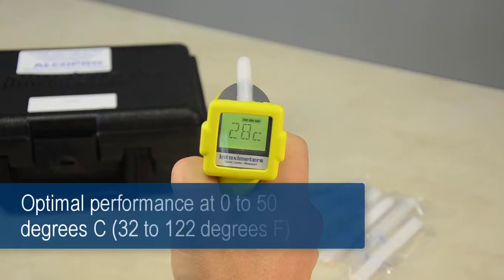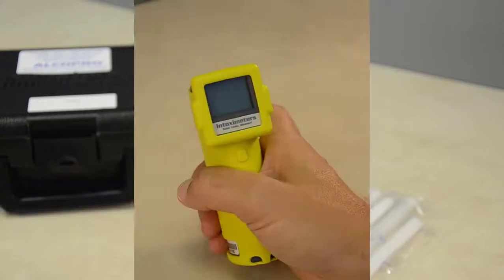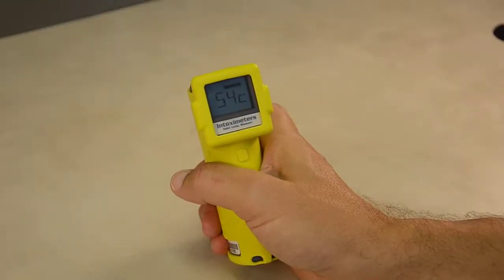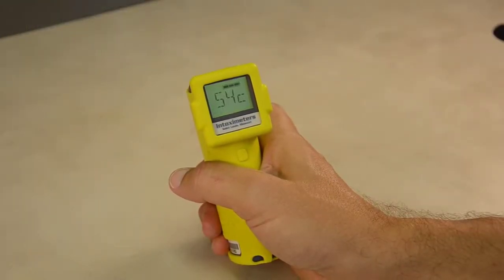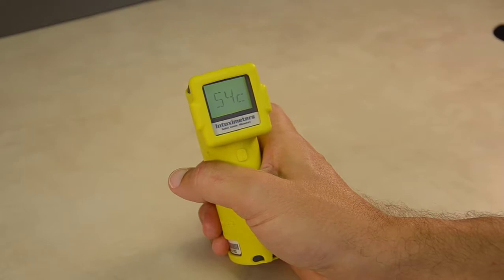The AlkaSensor FST is designed for optimal performance at instrument temperatures of 0 degrees Celsius to 50 degrees Celsius, which is equivalent to 32 to 122 degrees Fahrenheit. If the temperature is outside of the proper operating range, the device will indicate a temperature out of range message before powering off.